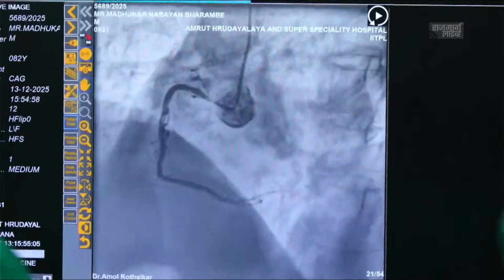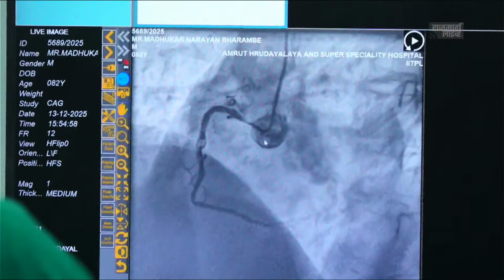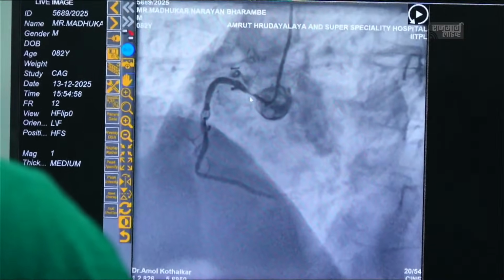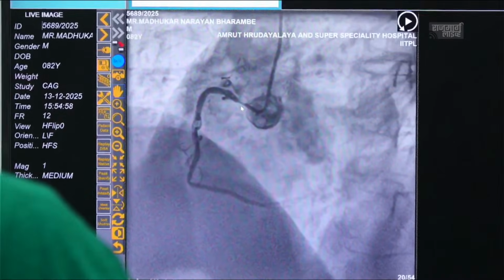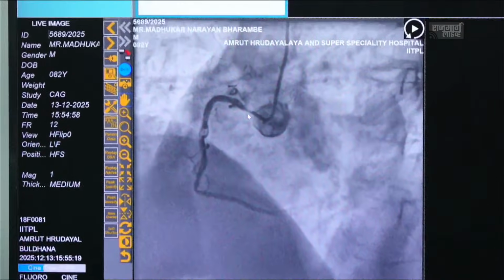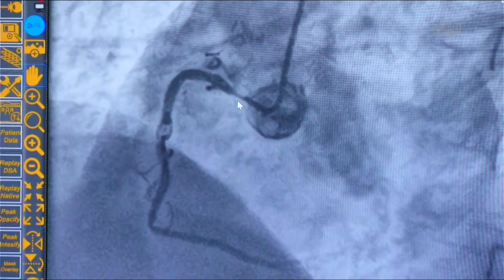Freeze, Tushar. Yes, you can see that just after the origin of the catheter there is a stenosis, and after that the vessel size is larger. The arrow is pointing to a very tight 90 percent stenosis in the right coronary artery. This patient will require some sort of revascularization depending upon his other arteries.